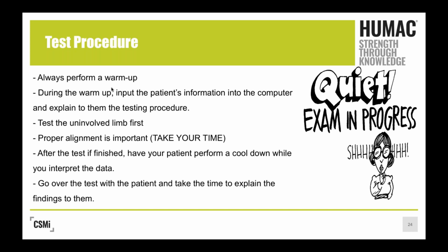After the test is finished, have your patient do a little cool down, 10, 15 minutes at most. That gives you time to interpret the data, to go over the graphs, go over the numbers. I like to do calculations and get my thoughts together before I present with them.